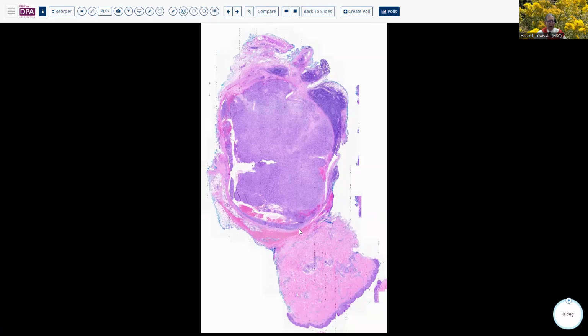treatment. They do tend to be somewhat more superficial, not in the deep fascia, they're superficial to the deep fascia, and most commonly are seen on the extremities. So that's another nice example of one of these intermediate soft tissue lesions that can have an inflammatory component as well.